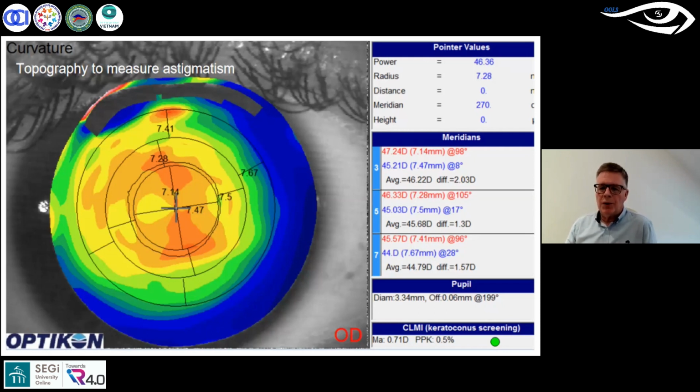And this is extremely important for contact lenses, even for straightforward, simple contact lenses. It's actually quite common that astigmatism, where we can see here this lovely regular and symmetrical figure of 8, pretty much disappears by the 5 millimeter marker. By the 7 millimeter marker, the eye is almost spherical. The computer indicates 1.5 diopter of astigmatism, but this has a lot more to do with the fact that the nasal cornea flattens out a little bit more quickly than the temporal.